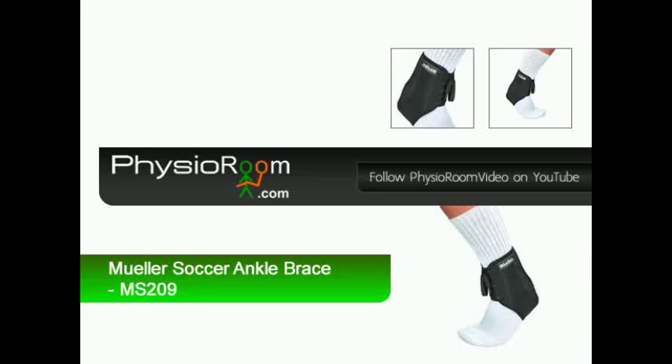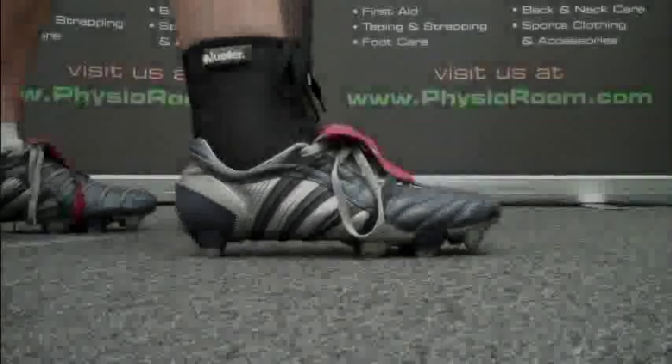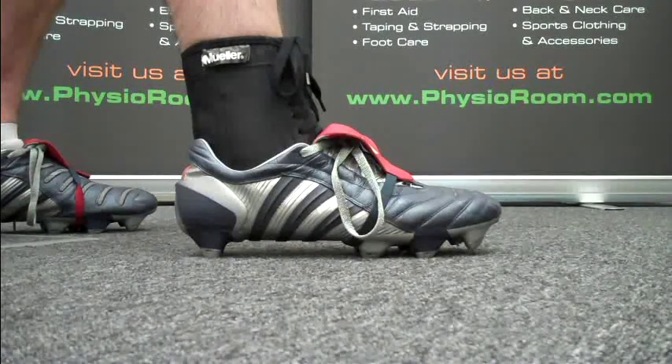The Mueller Soccer Ankle Brace is specifically designed to fit in your football boot or trainer to protect your ankle from sprains during active play.